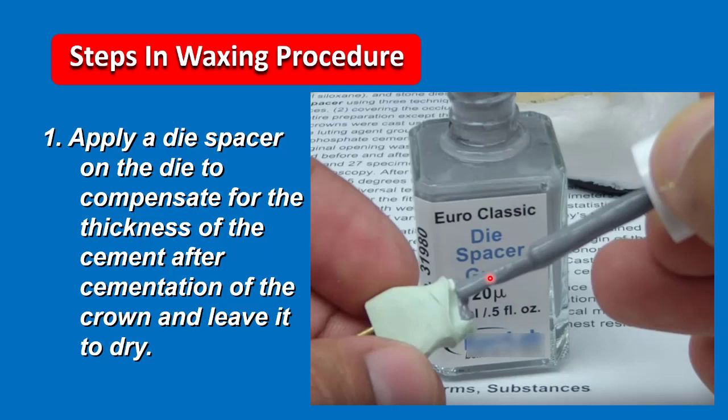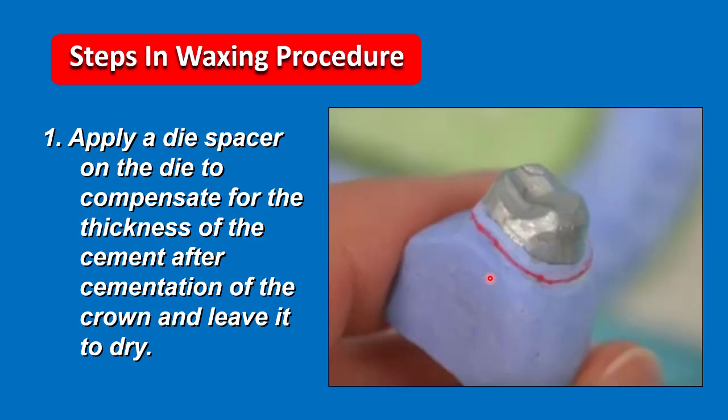The steps in the waxing procedure. First, apply a die spacer on the die to compensate for the thickness of the cement after cementation of the crown, and leave it to dry. As you can see here, we apply the die spacer away from the finishing line, no more than one millimeter.